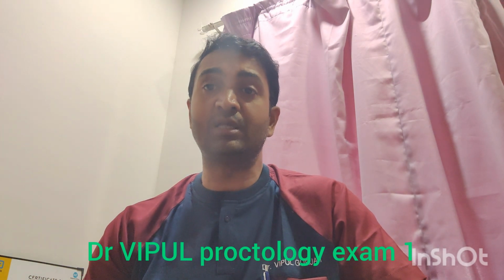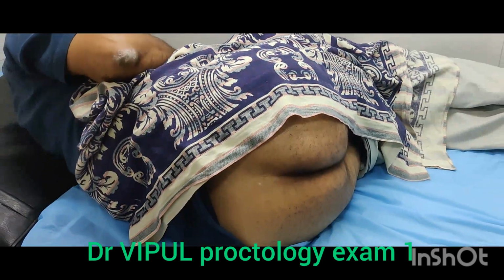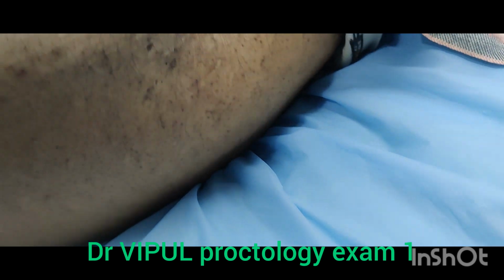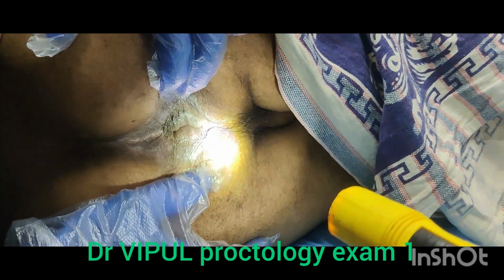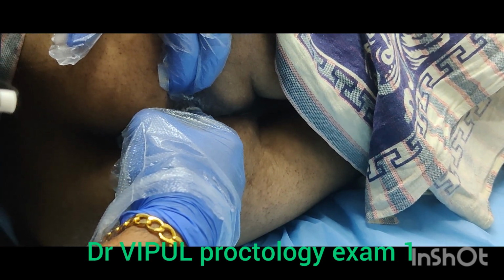Sometimes I thought this was a second degree pile that may need a simple laser surgery, but once these patients are taken for examination under anesthesia, there is a circumferential problem. This is how we cover the patient, the whole body except the perianal region. It gives some psychological support to male as well as female patients. We flex the knee and hip fully, which gives good exposure. Now I apply xylocaine jelly perianally and do the rectal examination.